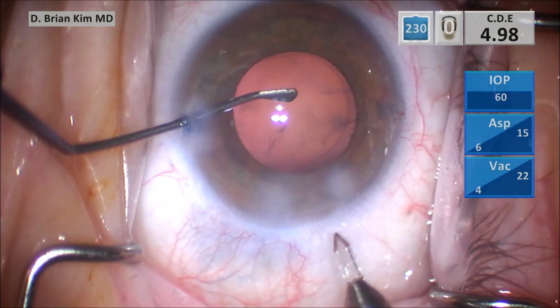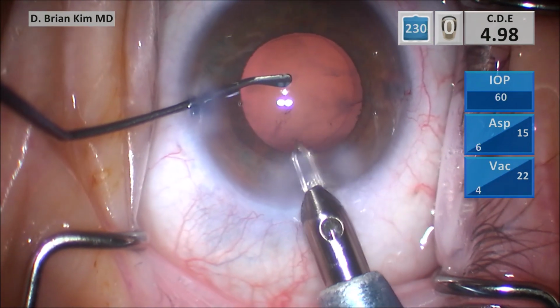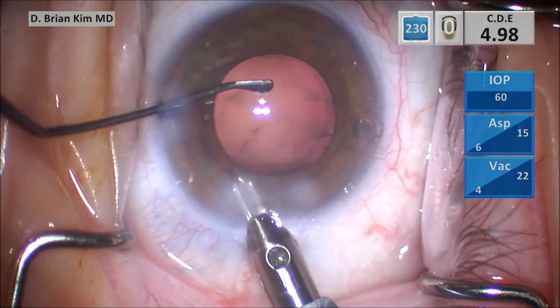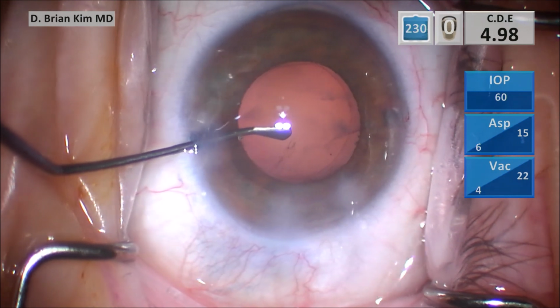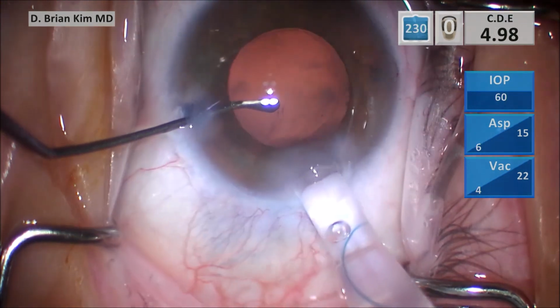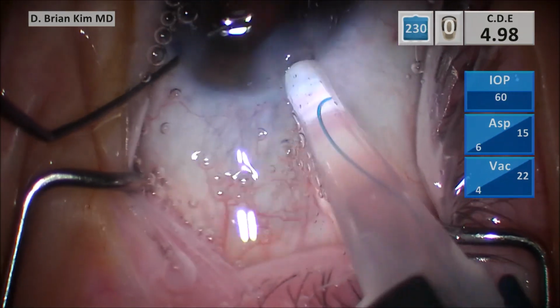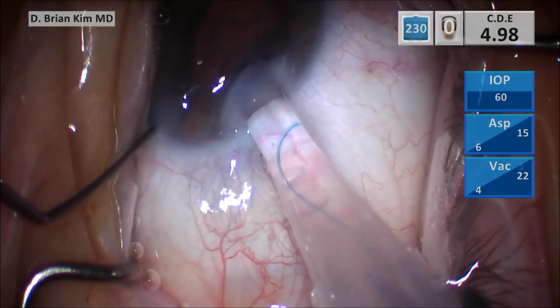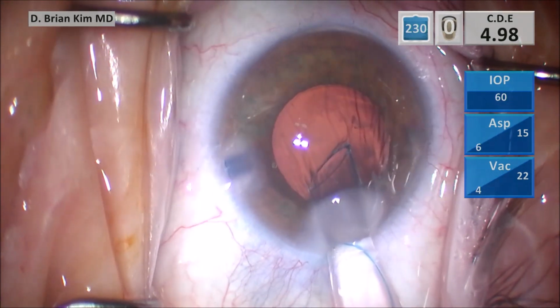I'm going to use this diamond blade to widen my incision. Again, I'm using a 2.4 millimeter incision, and with the 3-piece lens, you do have to widen it a little bit. So I'm going to widen the incision for the 3-piece acrylic lens. It's a little bit of a tight fit. Finally get it in with the bevel pointed towards the left.